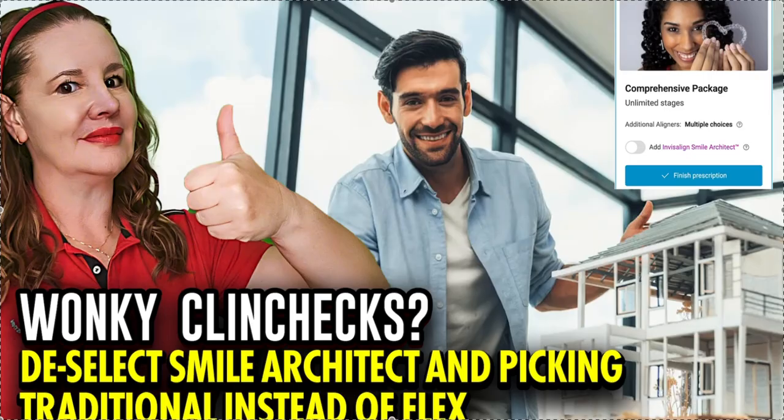You guys have been asking these questions, so I had to dig in real deep and get in with Grok and Genesis and Gemini and whatever they're called to find the answers to this, because there was nobody at Align Technology that was going to answer this question. And it seems like everyone's okay. I have a feeling someone's going to make me take this video down, but I'm just going to tell you what the AI told me.